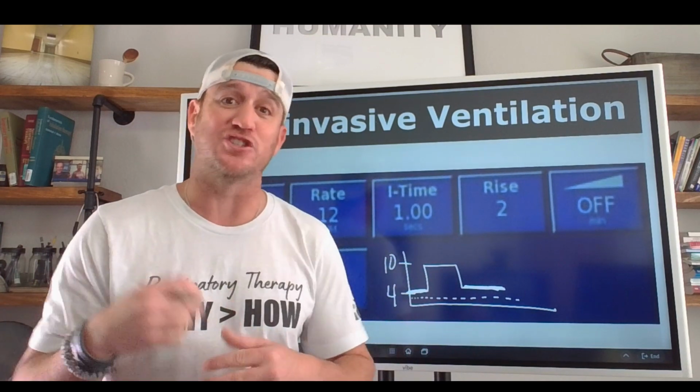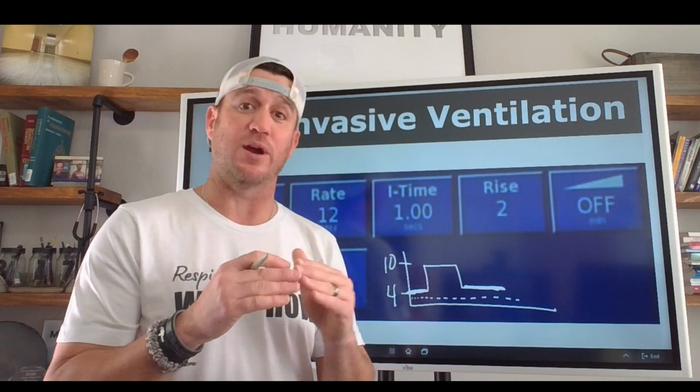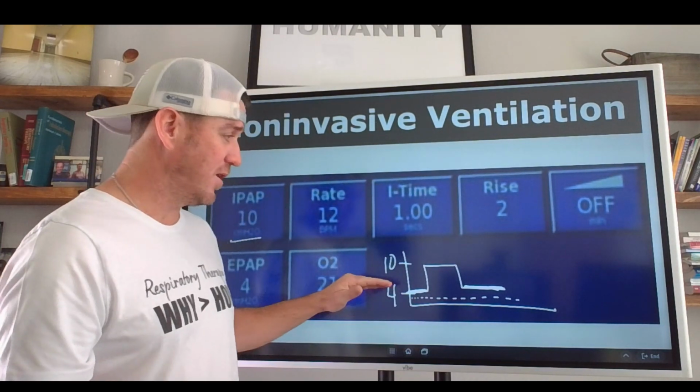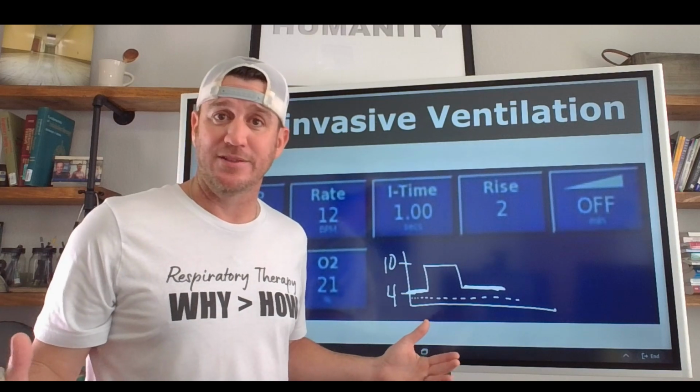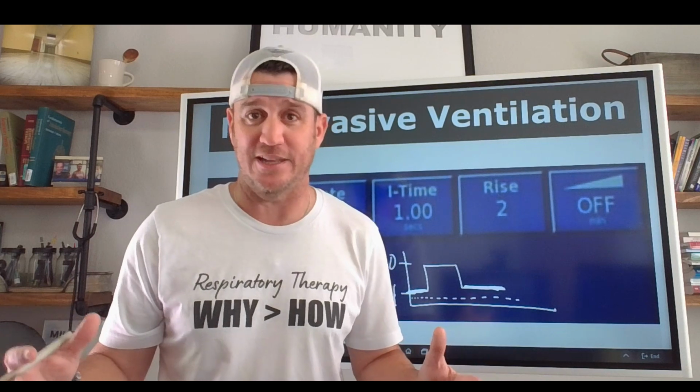And remember, it's going to alarm when we fail to get that high, when the inspiratory pressure does not get above that alarm setting. Well, we're above it all the time. So it's never going to go off. It's completely useless at this point in time.